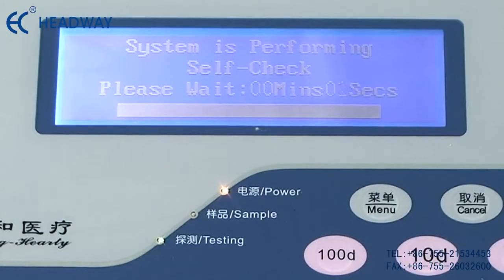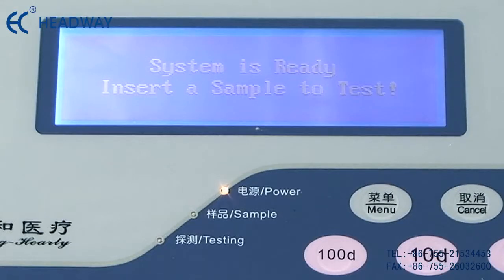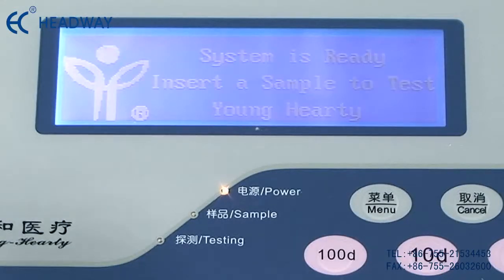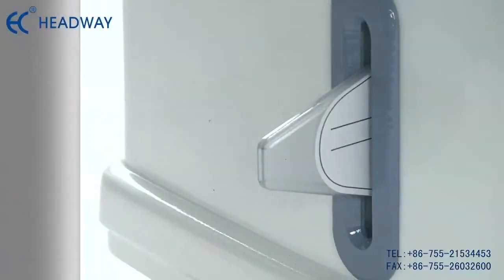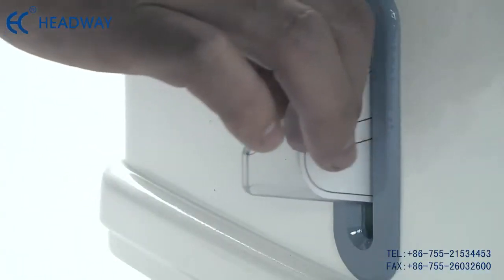When the test sample reaches the set time, the test result will be printed out through the built-in mini printer, including sample number, DPM value, and negative/positive result.